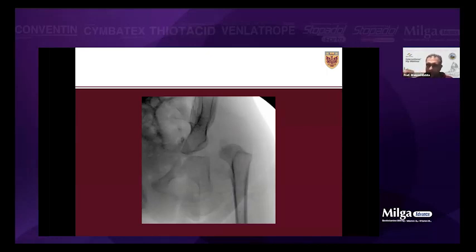So I make the skin incision. Usually distal to the ASIS, the skin is very thin and the subcutaneous tissue is very thin, but more proximal, close to the iliac crest, there is more thickness and more fat. So it's okay to go deeper with a knife proximally, except you get some bleeding. But be careful when you go distal to the anterior superior iliac spine, because it's very thin and it's easy to cut the nerve at this stage. I use the Bovie after the skin incision to stop the bleeding. And again, I use tenotomy scissors distal to the anterior superior iliac spine, just to be careful.